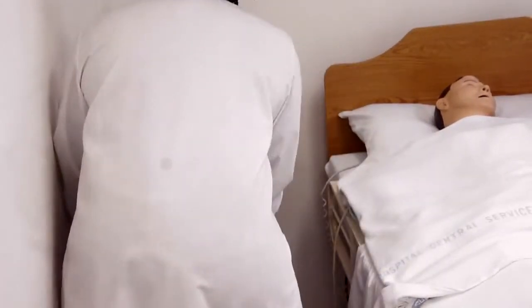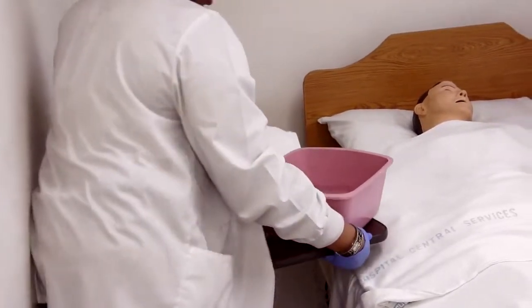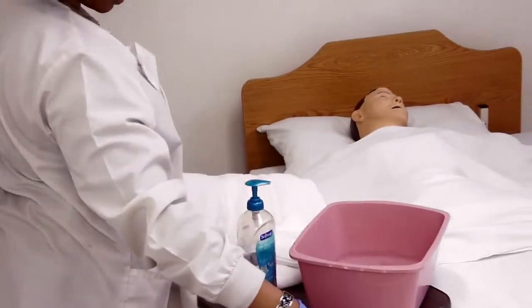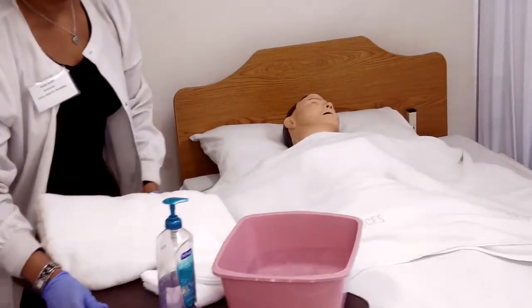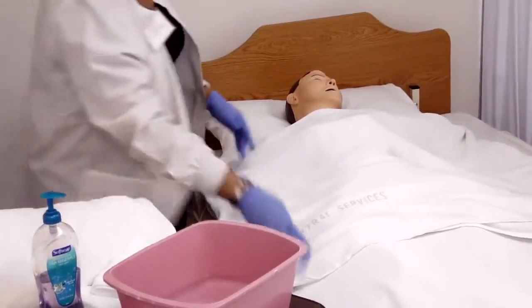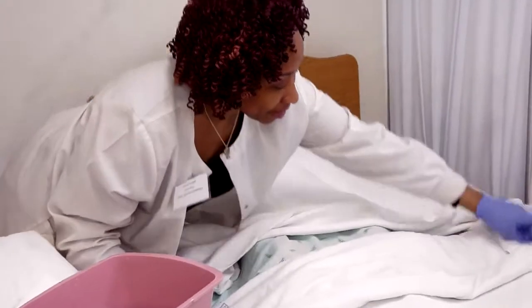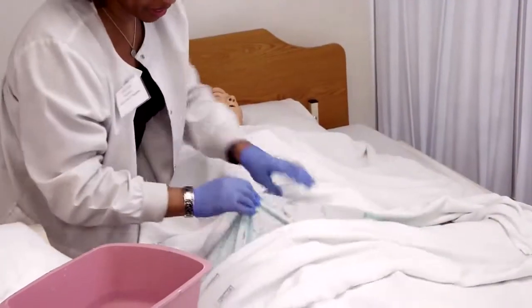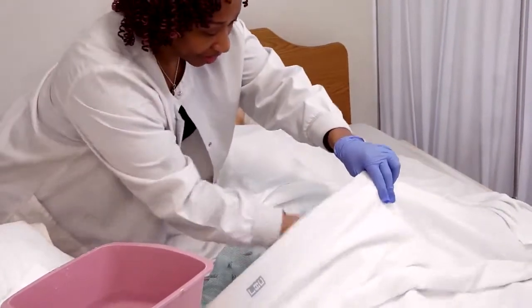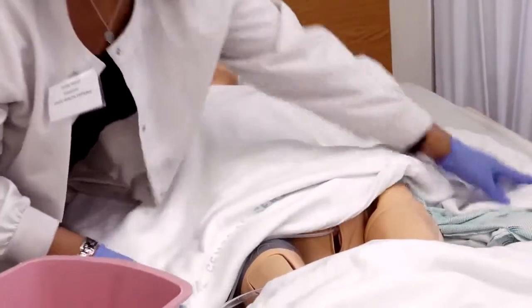Okay, so for catheter care, we need to bring our table in front of us. Be very careful. Okay, so we go ahead and we bring the sheet down to the knees. Again, only exposing the body parts you're going to be using. We bring the gown up gently without pulling the catheter. Just go ahead and tuck that under the blanket.